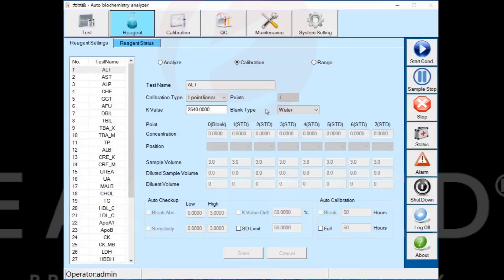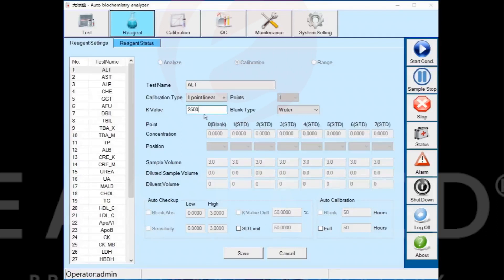Under one-point linear test items, you need to enter the K value and click the save button to save.